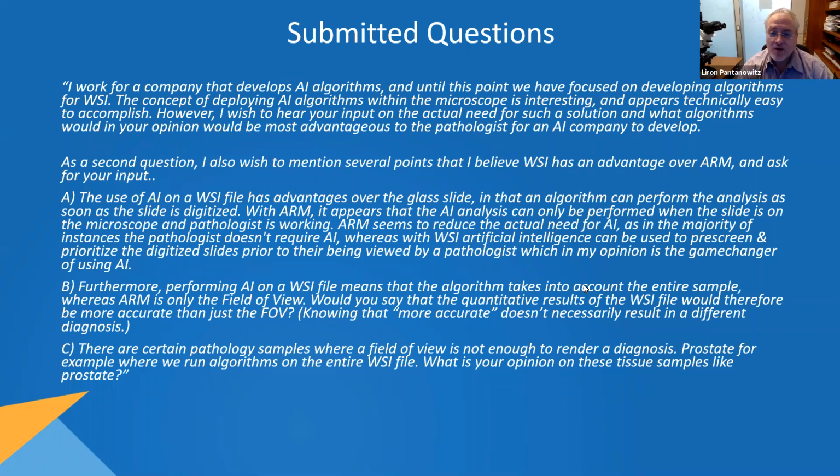So for example, when I look at prostate cancer, there are AI algorithms that are quite good at now detecting prostate cancer, diagnosing cancer, grading it, and so forth. But what I do is, in addition to that, I'm ready for any rare variant that comes along my way.